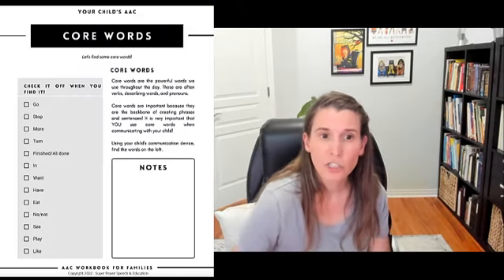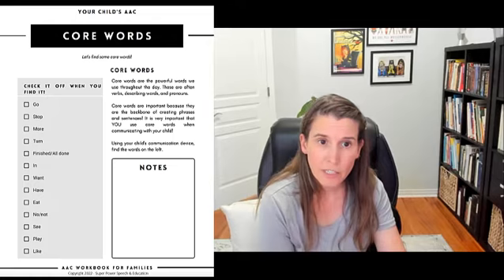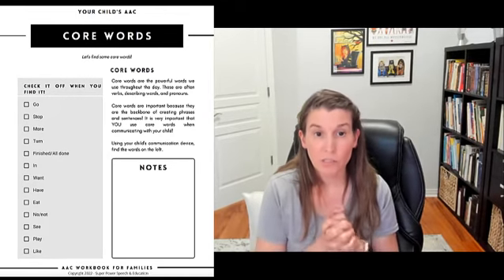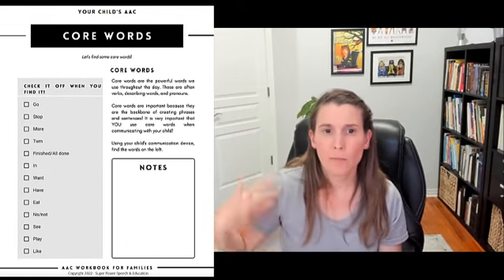Okay, let's talk a little bit about these words and what they are and where you find them. So in the world of AAC, we have these things called core words, which are kind of like your main, all-day, everyday, powerful words.